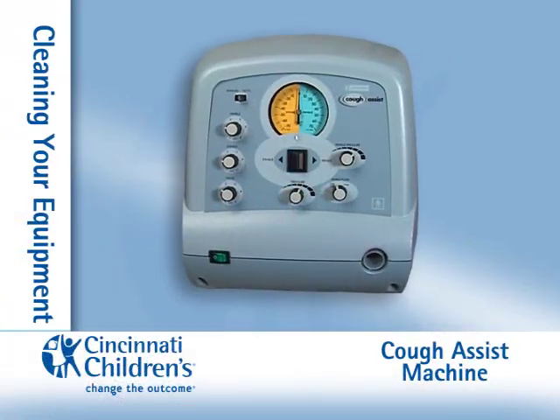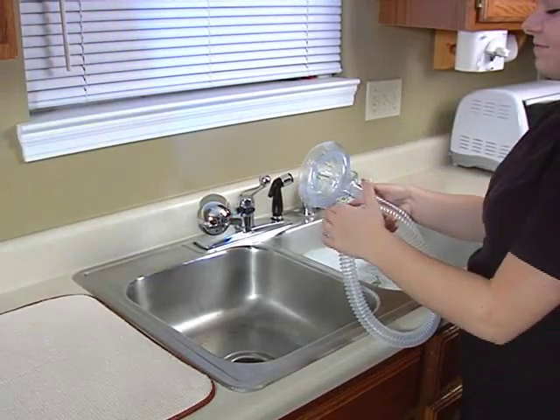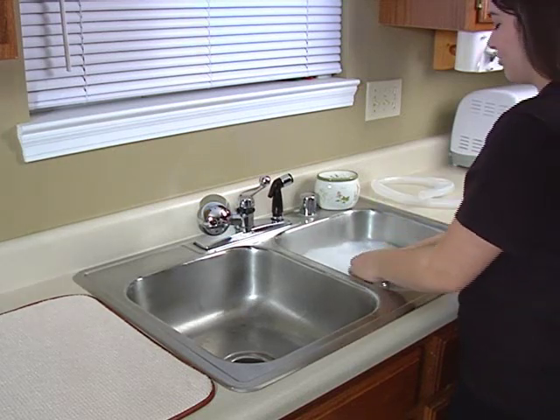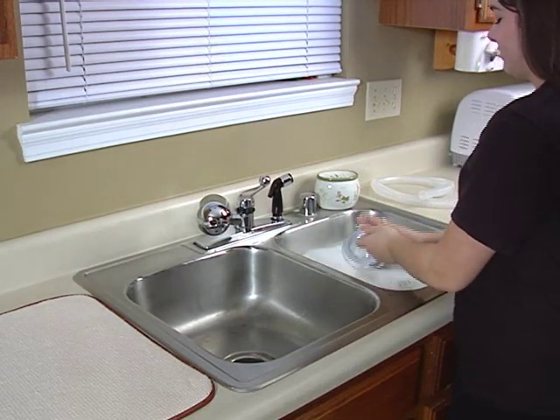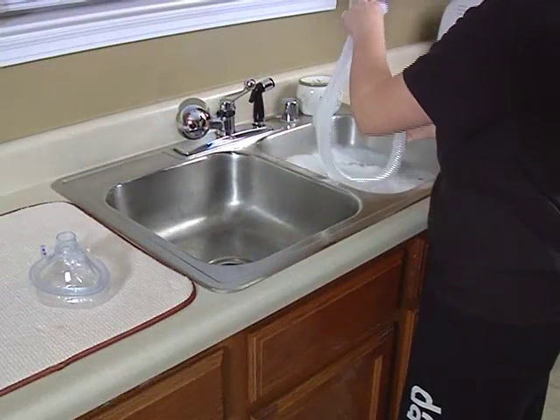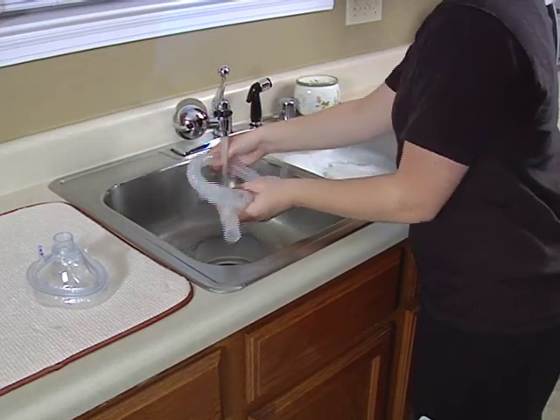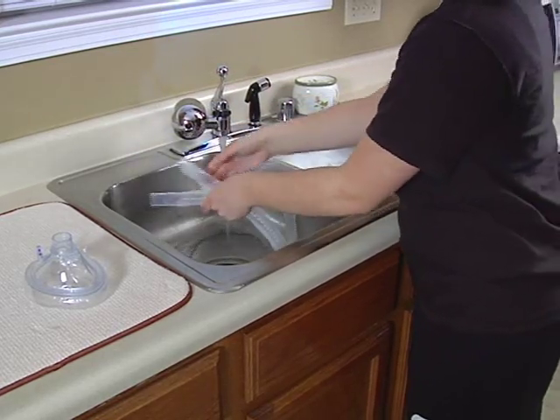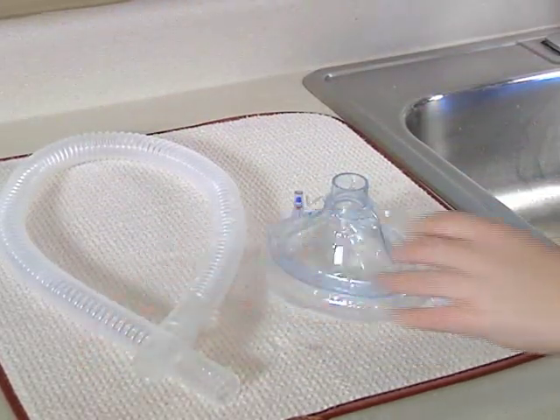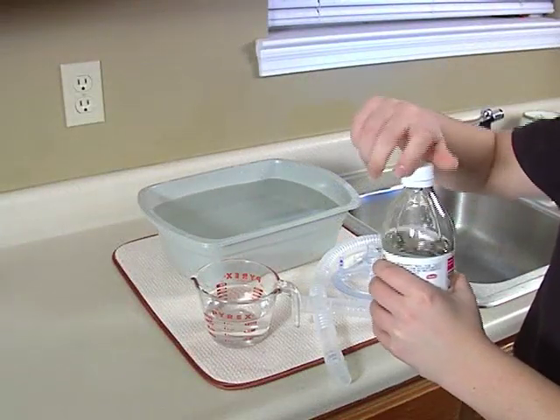How do I clean and disinfect my equipment? Daily — breathing hose and patient interface. Wash the tubing, mask, or mouthpiece in warm, clean, soapy water. Use any kind of dish soap. Rinse with hot water. Place on a towel and let air dry overnight. Weekly, clean and disinfect to prevent lung infections.